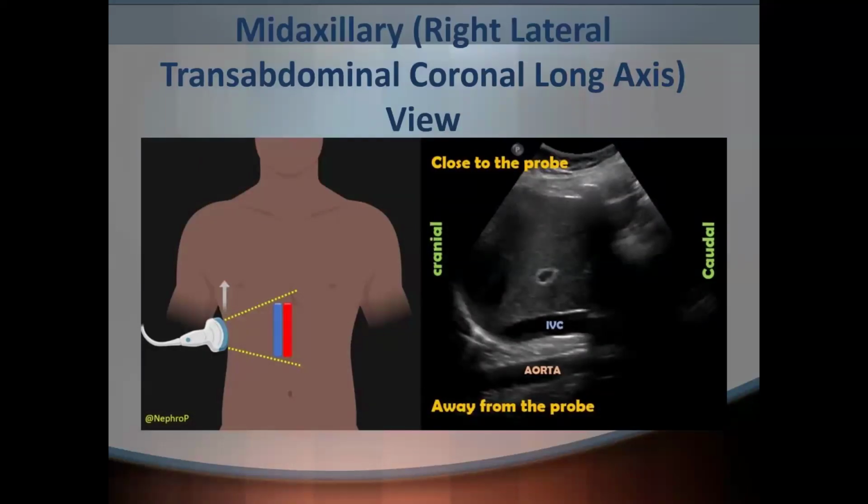Sometimes you have a patient coming post-operative, or with trauma to the abdomen, or who is obese, or has a scar on the abdomen. You cannot assess the IVC from the subcostal view. We have an alternative, the transabdominal or lateral view, but here we are not using the microconvex probe. We are using the abdominal probe because it has more penetration.